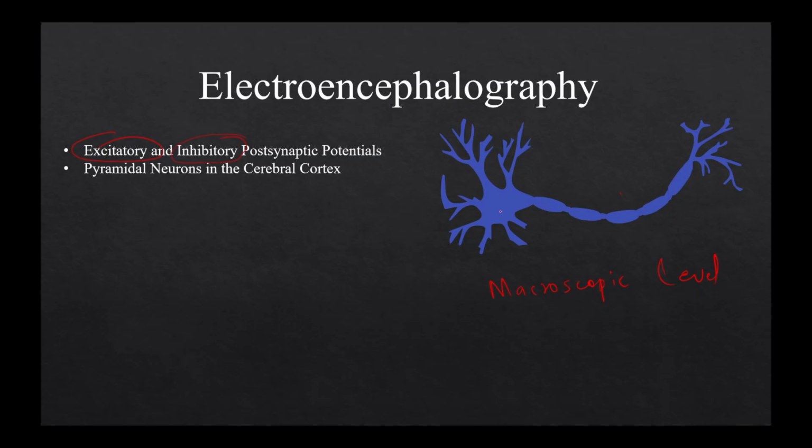So how do the neurons activate? These are dendrites. They receive neurotransmitter and it comes to the cell body. After summation, there is a certain threshold. If this activity crosses the threshold, the neuron fires along the axon, and here it synapses. After that, we are measuring the electrical activity of tens of thousands of neurons at the surface level in the case of EEG. And mostly these are pyramidal neurons in the cerebral cortex.